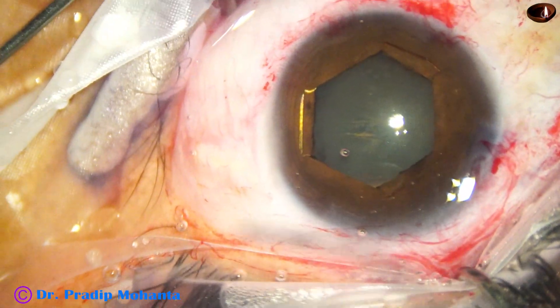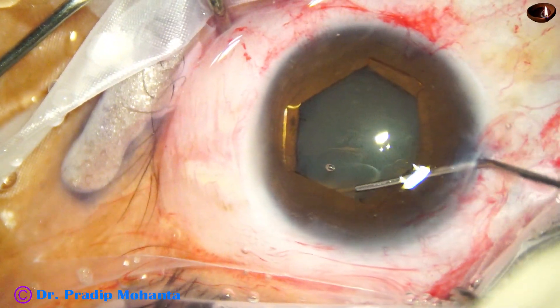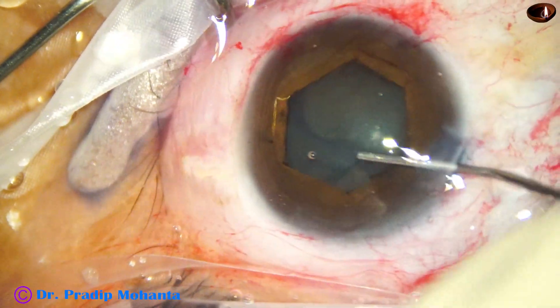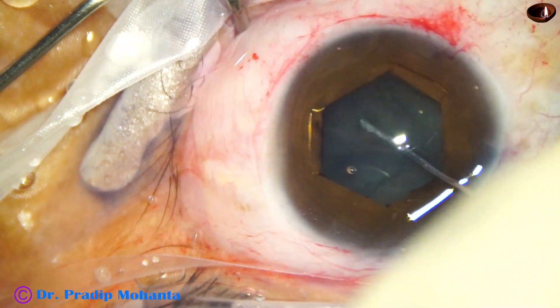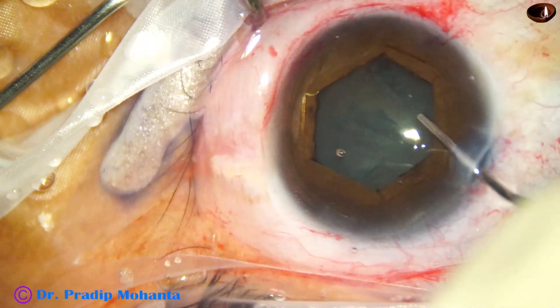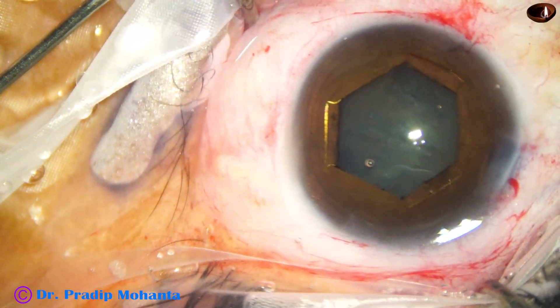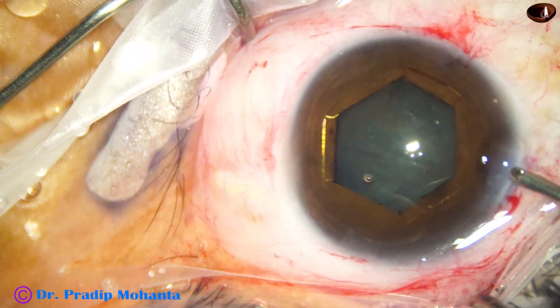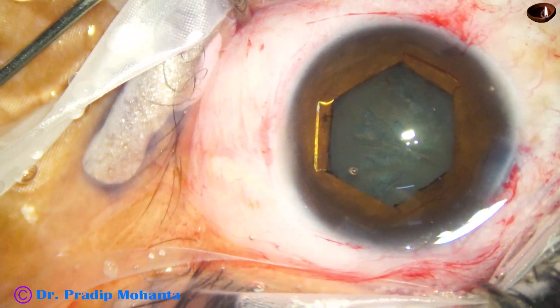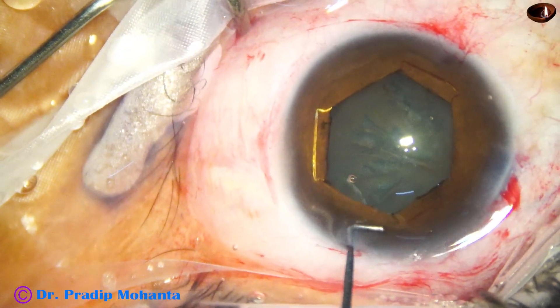Now the cataract is NS grade 1. The patient was not able to see because of the opaque pupillary membrane. We cannot just remove the membrane, as there is a chance of lens injury when we remove the membrane. So the plan is to remove the lens and place an intraocular lens.